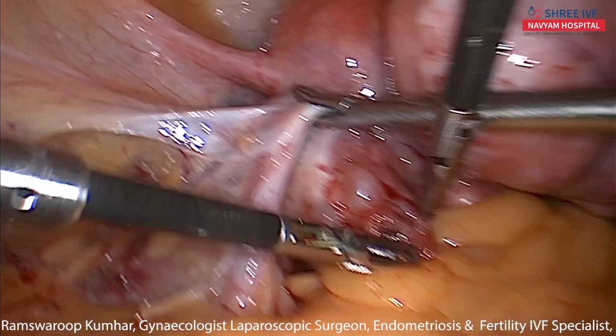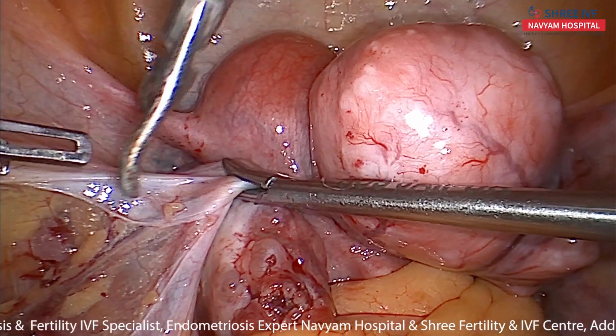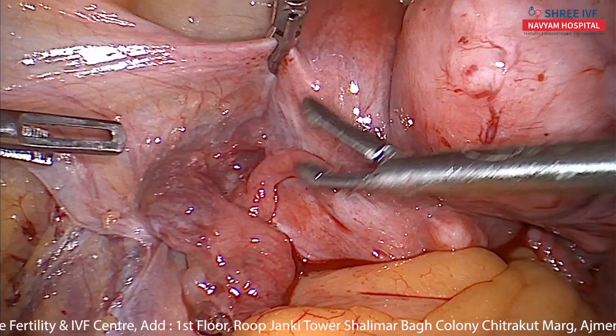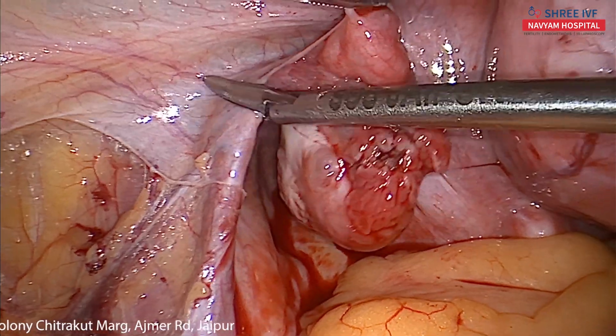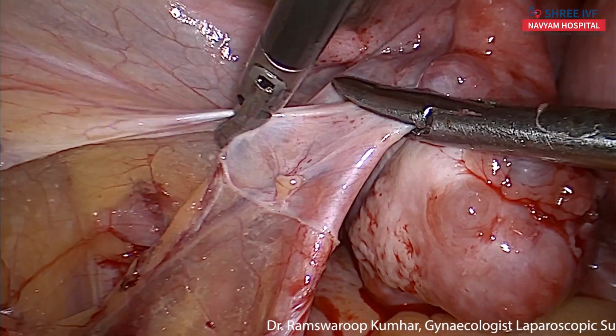This is the case of primary infertility, and the reason behind this is multiple fibroids embedded all over the uterus, and we are doing the laparoscopic myomectomy for this case. So our first step is bilateral uterine artery ligation, as we don't use vasopressin.